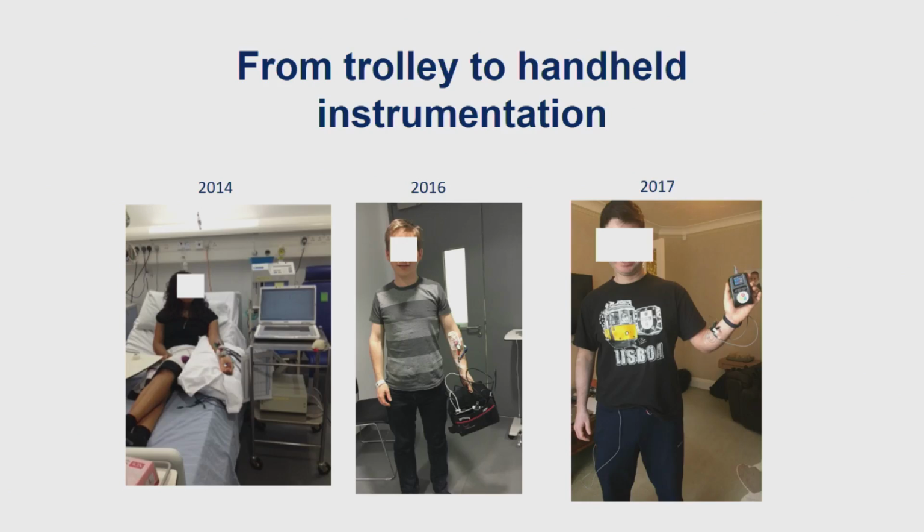Okay, and then looking at the instrumentation side of things, it's very important. I showed you in that image in the animal studies. If you had an instrument on a trolley, could you actually do animal studies? Can you have a trolley running around with a cow in the farm? No, you can't. And look at this here. So in phase 2, you have this young person holding a bag with the potentiostats in it. Can you give a cow a bag and ask it to carry it around?